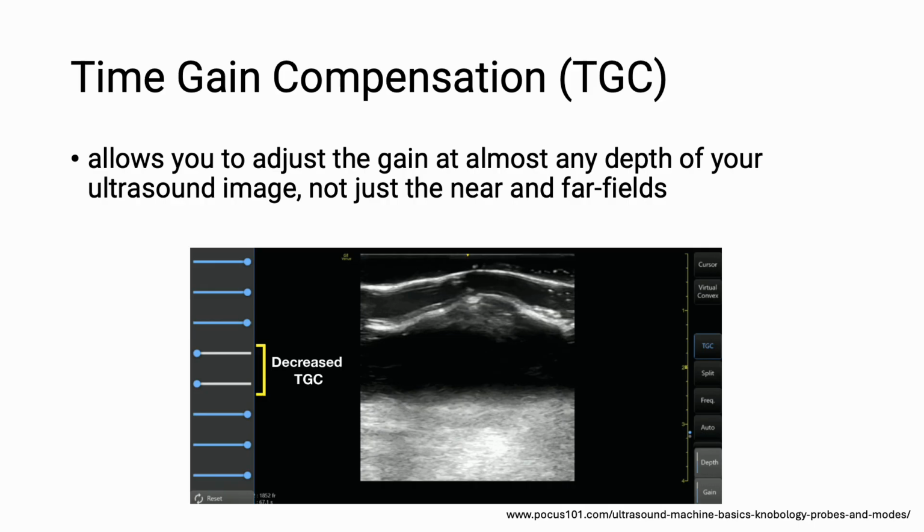And this is what you'll see on the more advanced sono machines, or the sono machines that you typically will use in your clinical practice, and not the little Sonosites that they roll in possibly in like an OB triage area, or sometimes in your clinic that you use. This is what the sonographers will have often on their ultrasound machines.